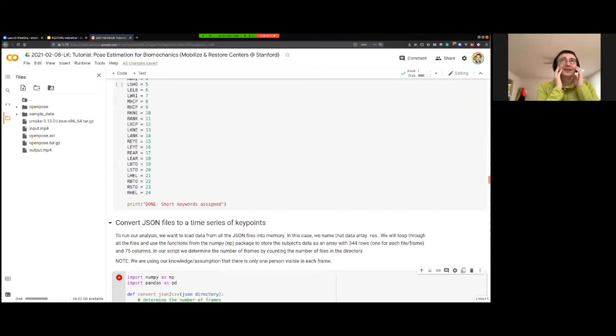That's a great question, and that's something that we've been investigating a lot. And we're actually explicitly running experiments to figure that out. So our thoughts so far is that the technology for some applications, maybe for simpler tests than walking, like the sit to stand test, which is common in physical therapy and in orthopedics and in assessing neurological disorders, seems good enough for assessing some parameters of those simpler movements.